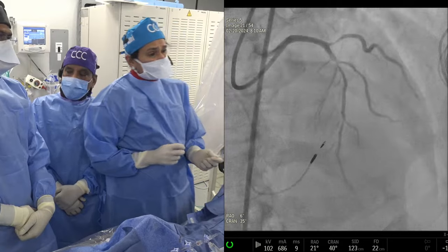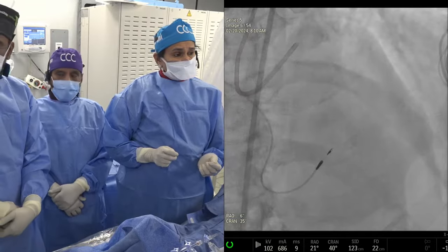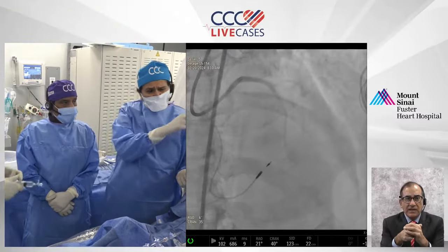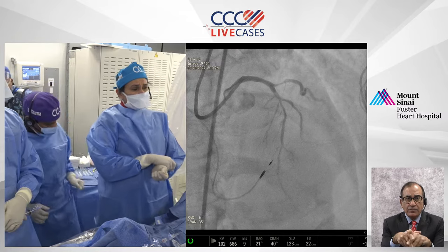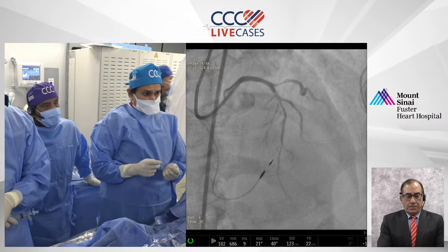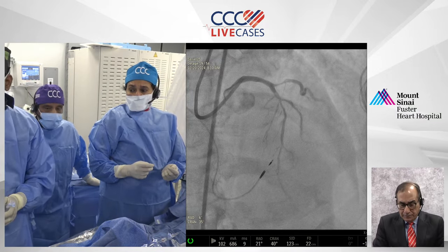2.5. Yeah. Oh, you want a cutting balloon? I would go 2.5 cutter for the diag. 3-0? No. Okay. 3-0-20. When you're talking about the cutting balloon, that would be both for the first and the second diagonal? 2.75. No, for the D2. Yes, yes. First, right now, we will go with the 2.5 to the D2. D2, okay. And 3-0 we can use for both of them, or 2.75 for diagonal and the LAD. Okay, 2.75, 20 for the LAD.